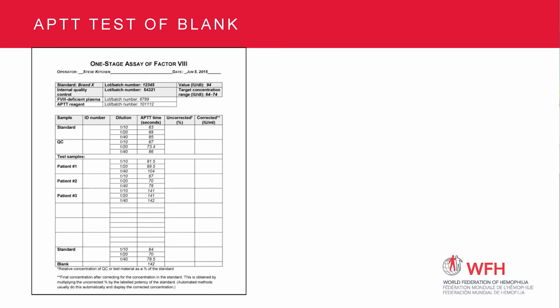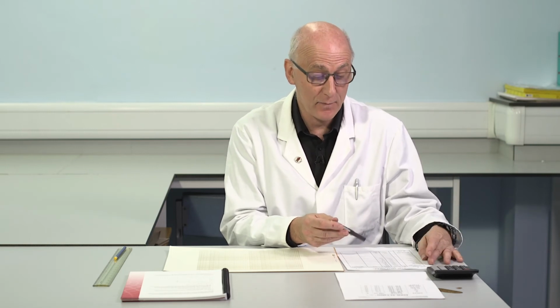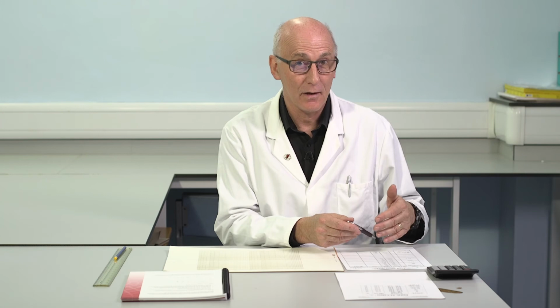The 1 in 40 dilution at the beginning of the assay, 85 seconds. For the calibration curve we ran at the end of the assay, the 1 in 40 dilution, 78.5. So that's quite different, 7 seconds. That's a bigger difference, almost 10%. Normally we would expect the clotting times to be within 5%. So that's quite a difference. At this point, it's possible that one of those includes some error, some imprecision, and we'll be able to reach a judgment on that when we take those clotting times onto the graph paper, which is the next step.